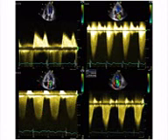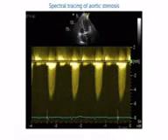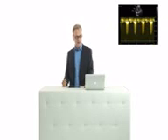So what does the signal tell us that we have in our patient? Well, we have a velocity which moves down or away from the transducer. That's why it is negative. And we have a certain velocity which is somewhere in the region of maybe almost 6 meters per second here. And we see that we are imaging now from a 5-chamber view, which means this has to be the velocity jet that goes in this direction, away from the valve. So this is the signal of aortic stenosis. Good.